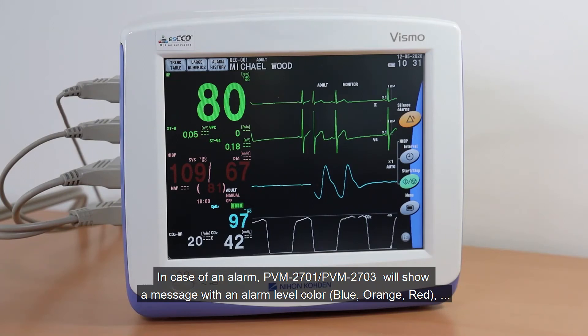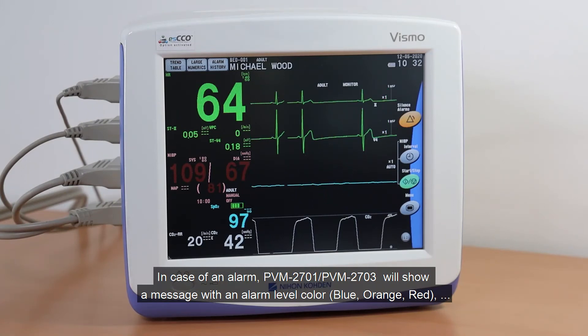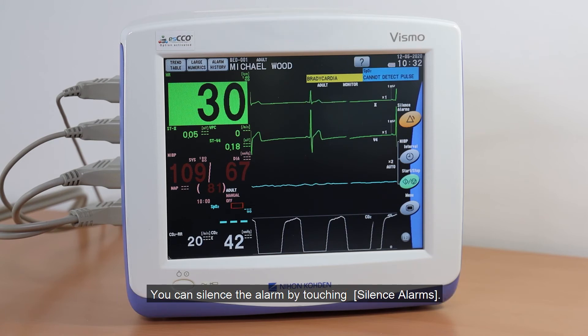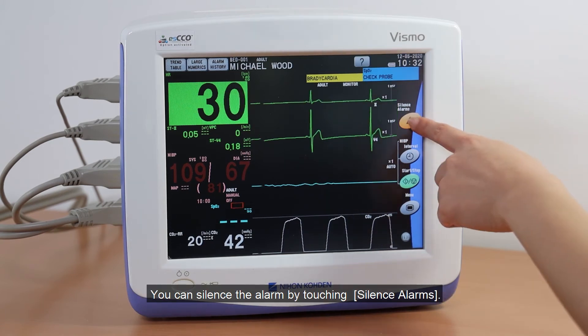In case of an alarm, the monitor will show a message with an alarm level color — blue, orange, or red — a specific sound for the alarm level, and highlighted numeric data. You can silence the alarm by touching Silence Alarms.